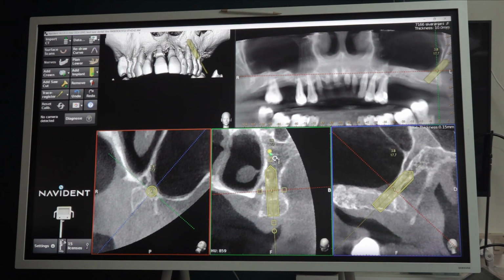You have to start the correct way, and both medial and distal angulation should also be correct. That is why the pterygoid becomes more critical. Anything can go wrong, and the cases get missed. The important thing is there is no second opportunity. Once you drill and place the implant, a second or third drilling is not at all possible. Even if you try a new drilling, it will mostly go into the same path. It's a very small area. So with pterygoid, you have only one chance. You cannot make mistakes and try to correct them later.